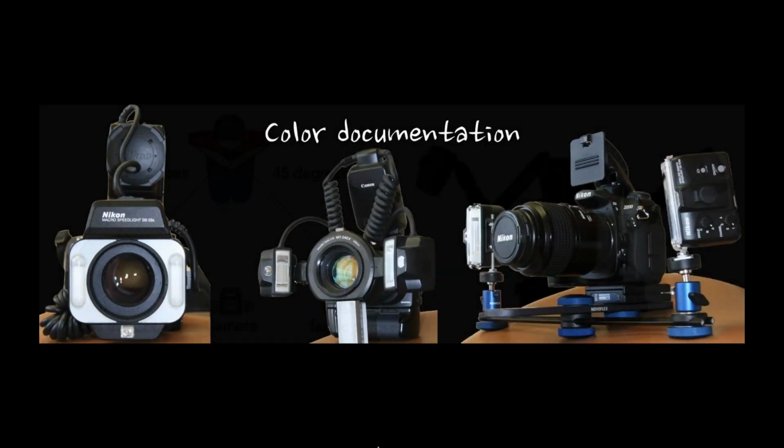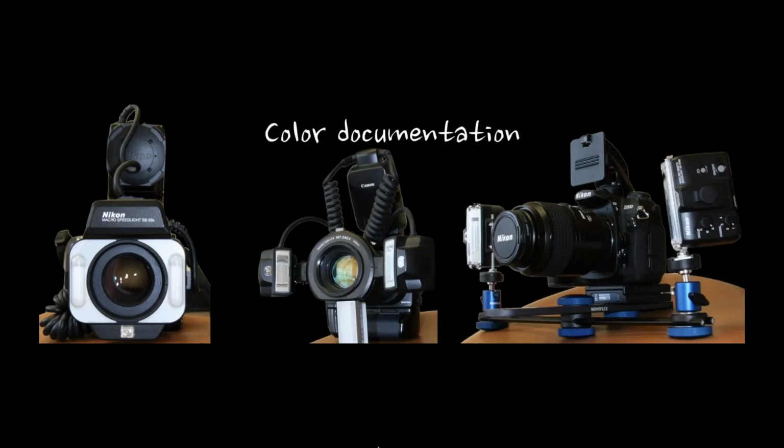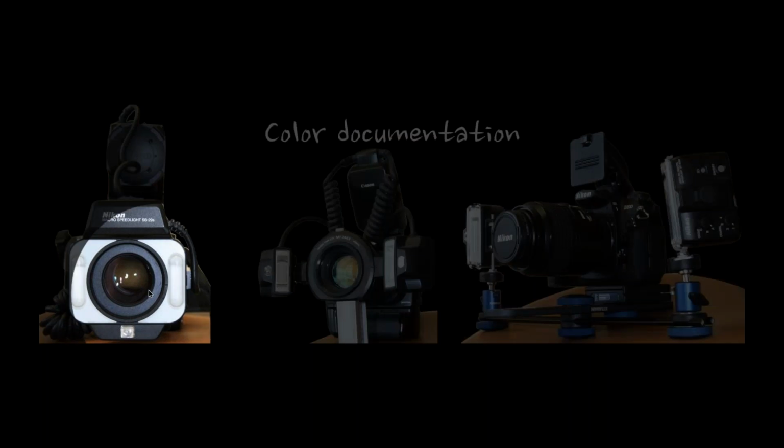Okay, let's go into the flash part of this. That's the basic body. Now we'll talk about the actual flashes. This is something that I've battled for a lot of years. Most of the doctors today have these little things called ring flashes. And ring flash to me does not have anything to do with how many lights are on the flash. It has to do with what's holding it on the camera. So anytime you're attaching something to your ring, it means it is a ring flash.